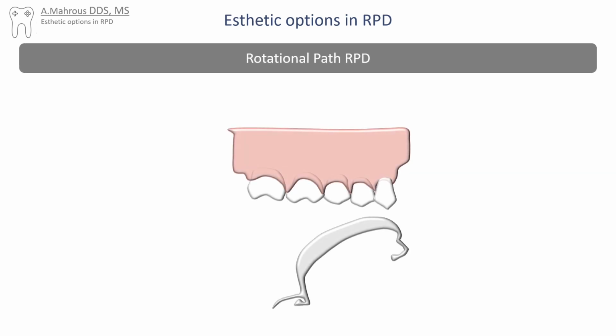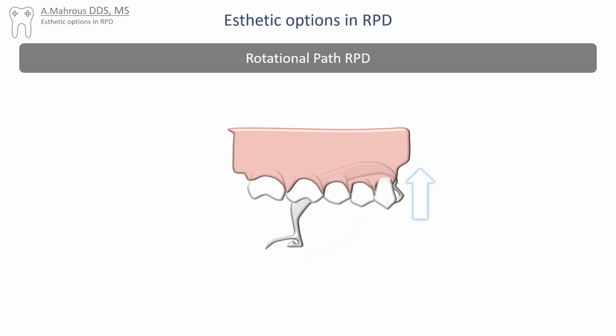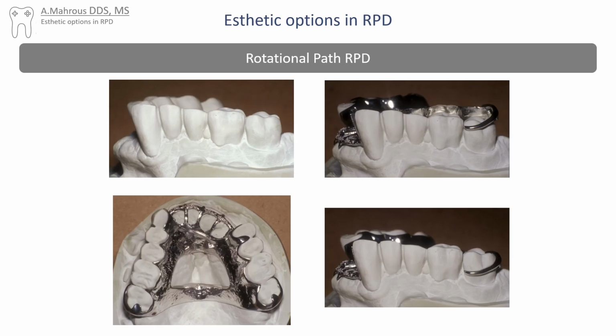Rotational path RPDs avoid having any clasps in the aesthetic region by having two paths of insertion. The first path is straight up, and the second path is rotational. This allows the RPD to retain itself using the mesial slope of those anterior teeth without the use of any clasps. Rotational RPDs need a lot of planning and require a skilled and experienced lab technician.